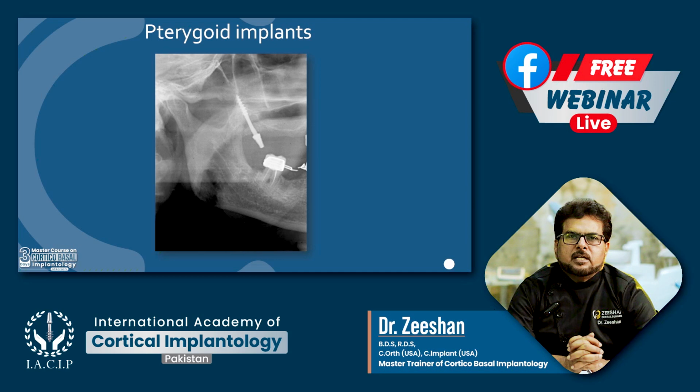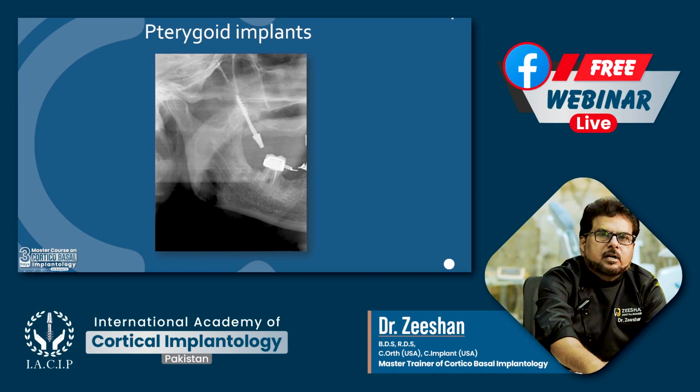and placing at an angle or tilted angle can provide you the placing of a longer implant. Placing a longer implant means you are increasing the bone implant contact and you are engaging it deeper into the second cortex. So bicortical implantology, you are achieving the bicortical implantology here.